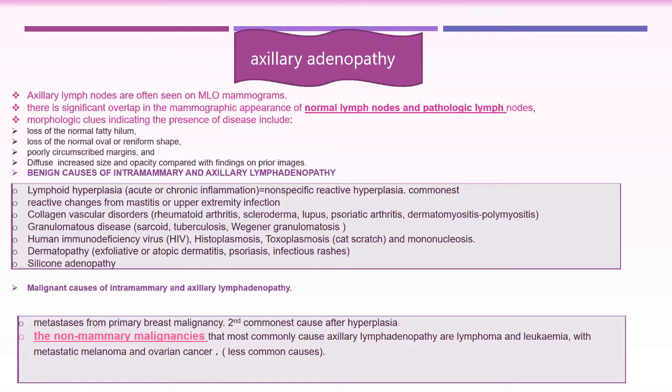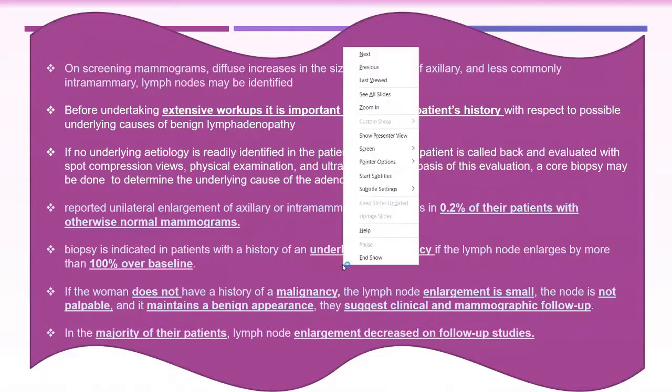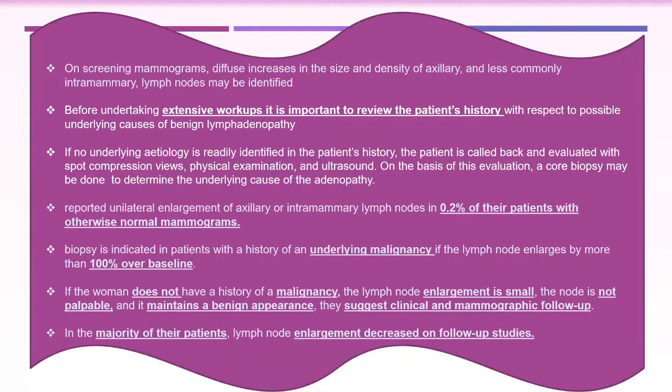So in screening, it's common to find lymph nodes. Lymphadenopathy is seen in 0.2% of patients with otherwise normal mammography.